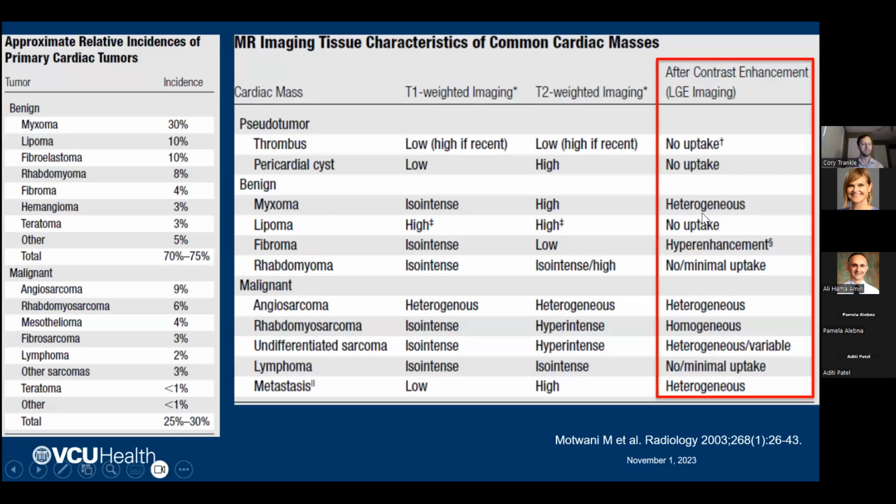As you inject the contrast agent through a peripheral IV, you can watch the first pass perfusion as the contrast enters the venous, then the pulmonary arterial, then the left ventricular cardiac chambers, and then the arterial phase, and then it starts to perfuse various organs, the heart itself, or something nearby the heart that you want to know, does it have avid perfusion? You could take advantage of these perfusion sequences.